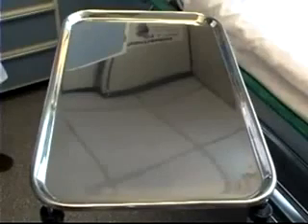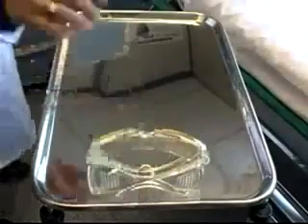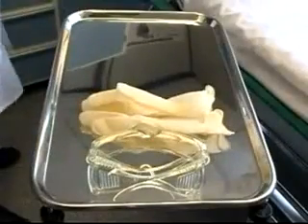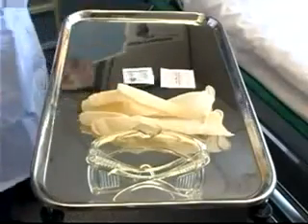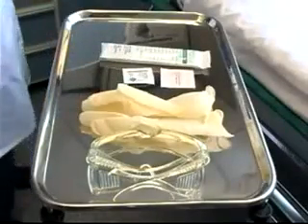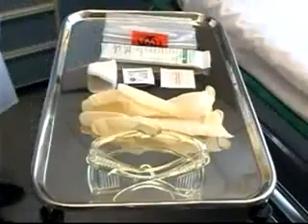The equipment necessary for arterial blood gas sampling is protective eyewear and gloves for universal precautions, a povidone-iodine swab followed by an alcohol swab, an arterial blood gas sampling kit, 2x2 gauze, and a bag of ice to put the sample on to send to the lab.